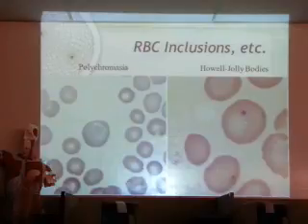And on this side, we have these purplish inclusions. They're about 1 micron diameter, dark purple, usually round inclusions. And that color looks just like a nuclear color, right? In fact, these are pieces of chromosomes, chromosomes that somehow got left behind when cells divided early on.